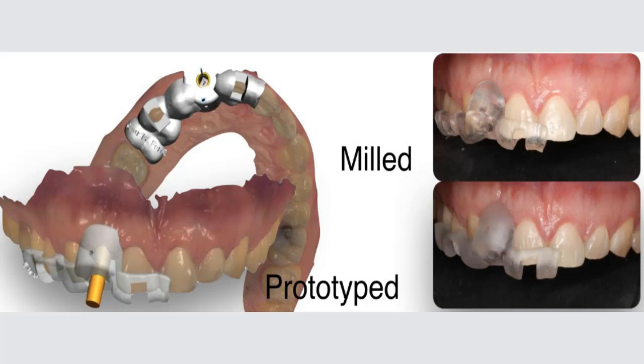Why? Because every time you design something, the information that you provide, for instance for the printing, goes into the STL file. So if you create your file using a strategy for milling, then your STL will have the information for the milling.